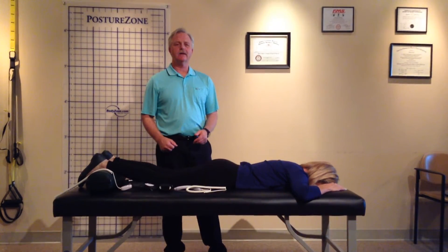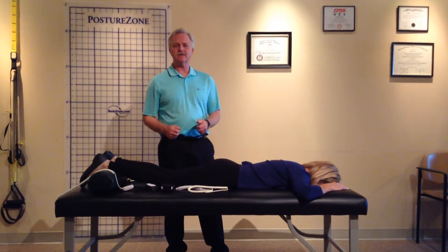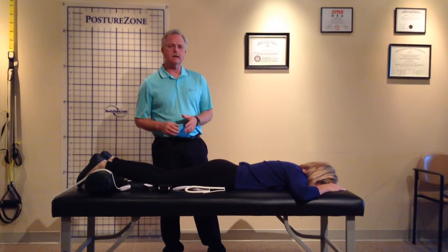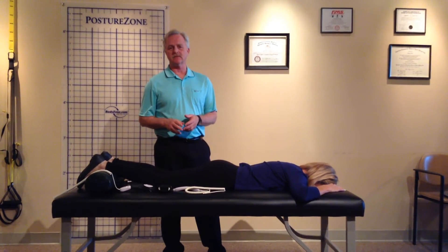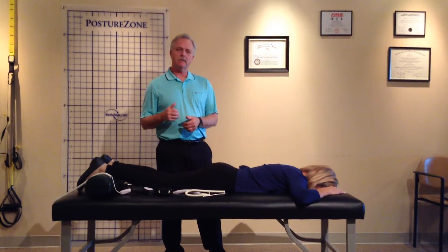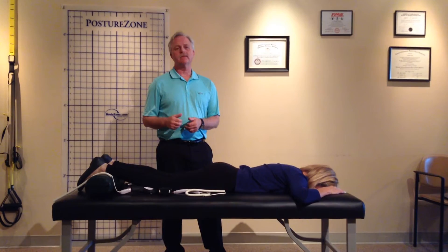Hi, I'm Dr. Steve Lund. I'm a doctor of chiropractic and a licensed massage therapist here in Clearwater, Florida. I want to talk to you today about the Microlite 830 laser. I've been using this laser for about three years in my practice. I absolutely love this laser.